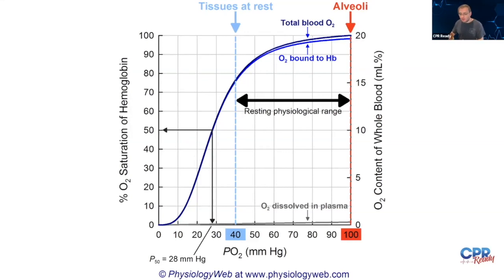So when you're analyzing your O2 saturation readings, just keep this in the back of your mind. This will help you not only understand why a little bit of oxygen goes a long way, but also that some of our patients are right on that danger zone. And though they don't look quite that bad yet, they can crash once that demand increases. And there's lots of other things that can affect this that's way beyond what we're going to talk about today.